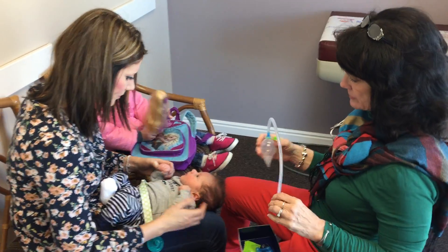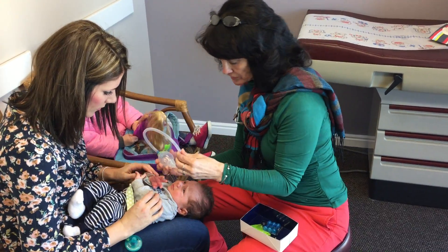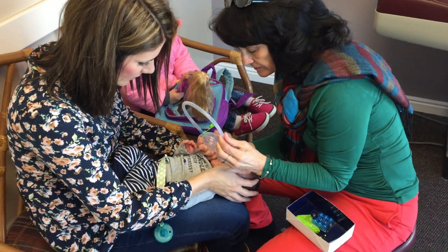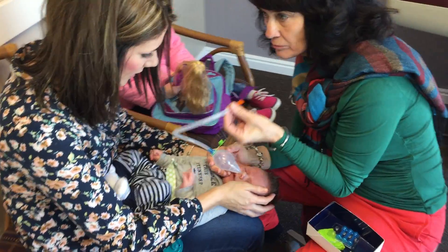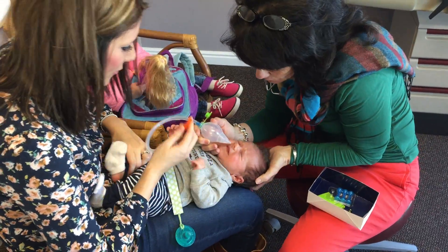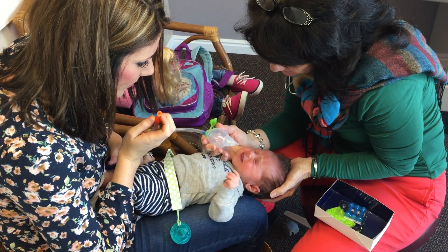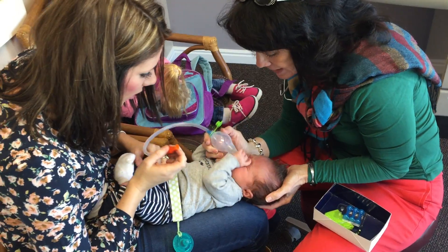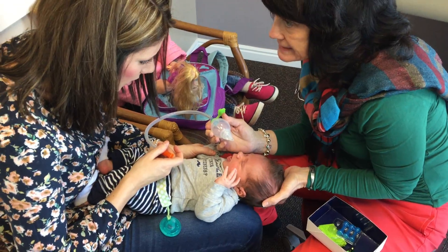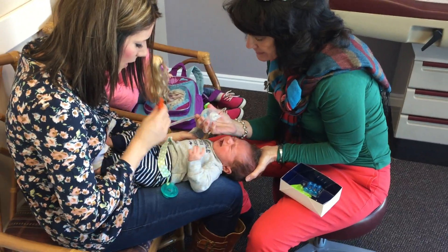So I'll just kind of demonstrate and then let you do it so that I don't contaminate it, because this is yours. So the soft little tip, you just put in their nose like that. And when you gently put your mouth on it, it just sucks. It aspirates, and then you can go to the other nostril. If it feels like you're not getting anything out, you use the saline drops first to moisten, and then put the little tip in and suck out.